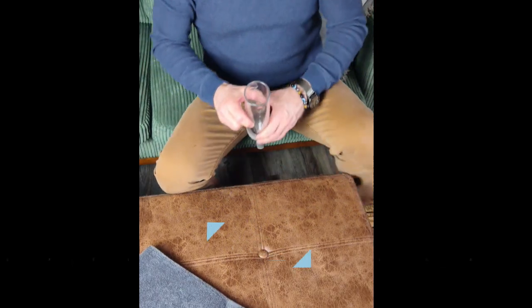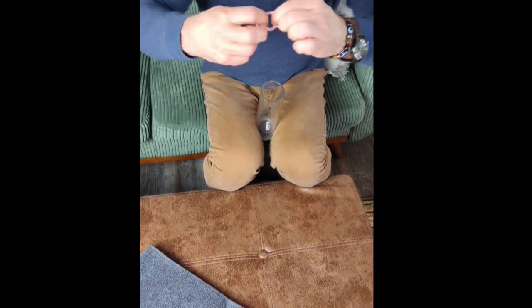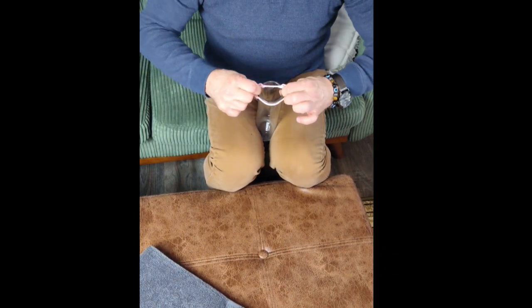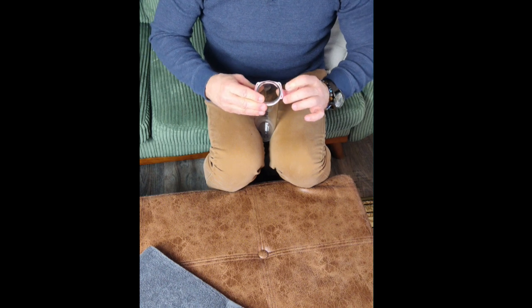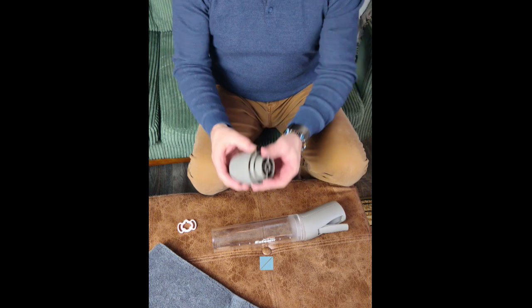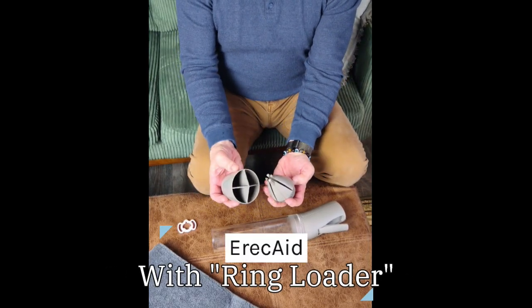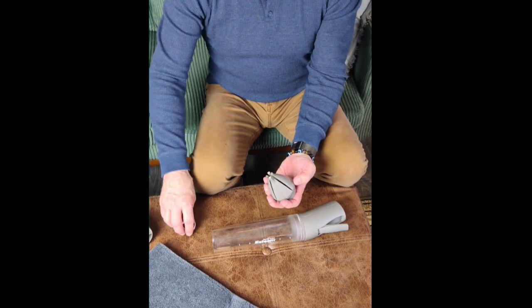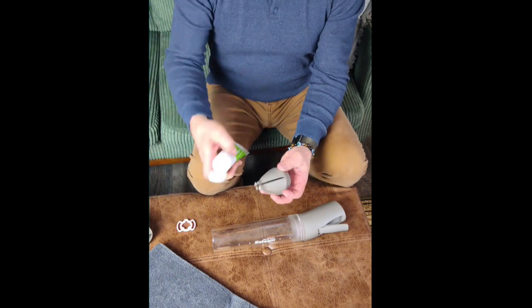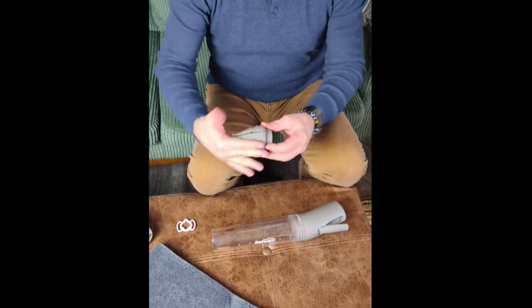All right, first we're loading the ErecAid tension ring manually. Just get on the inside of the diameter of the ring, straddle the cylinder, just load it on manually, just like that. We're also looking at loading the ErecAid tension ring with the ring loader that comes with the system. And here I just want to make sure I lubricate the entire device so that the tension ring will slide down easily, not roll upon itself.